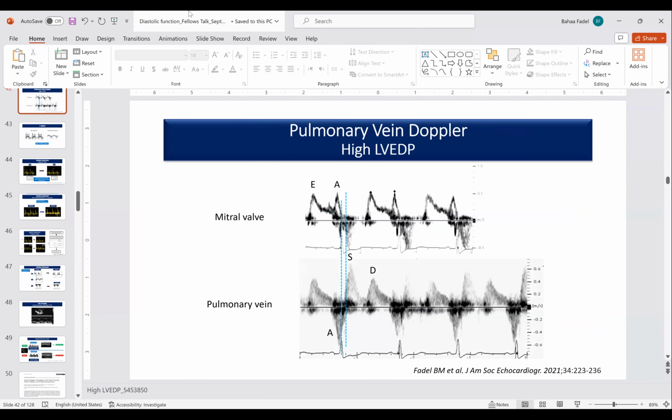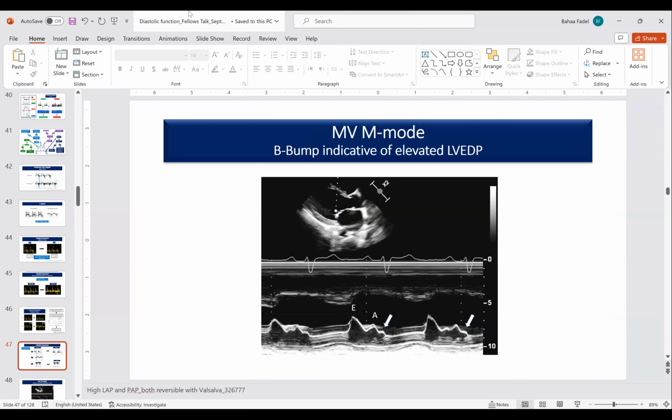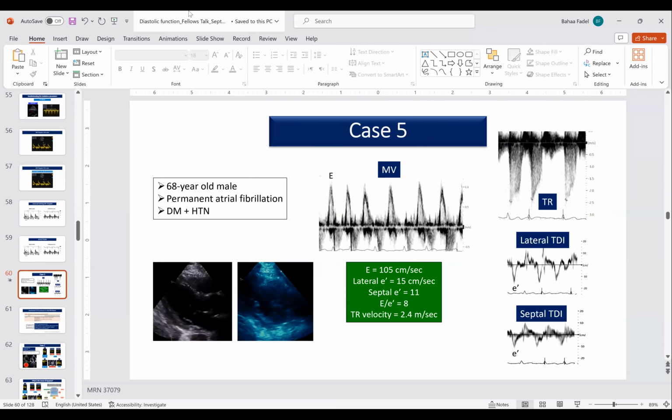So you need to do proper assessment, but in order to do proper assessment for the patient, you really need first to slow the patient down. I mean, give the patient time to slow down and repeat the echo. And look at these parameters. I mean, the E velocity tends to go up, and the deceleration time tends to go down with AFib. So you need to first determine, does your patient, for example, have normal ejection fraction, GLS, or has no abnormal systolic function? That's important to know.